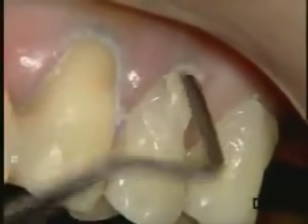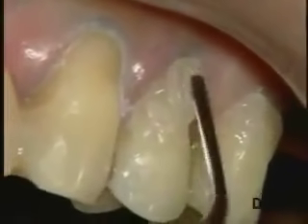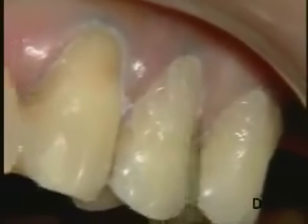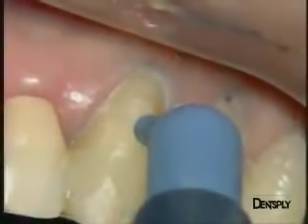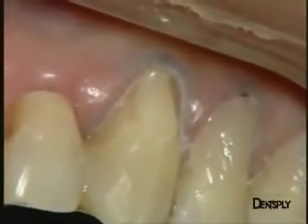A final layer enables us to slightly accentuate the cervical convexity to allow better and non-traumatic brushing, and therefore avoiding further root surface abrasion. A final cure completes the work on tooth 24. Shade A3.5 is now selected to reconstruct the canine. The technique used is the same.